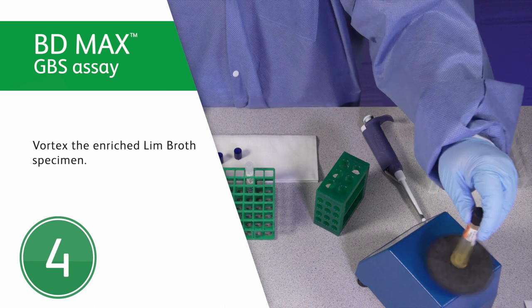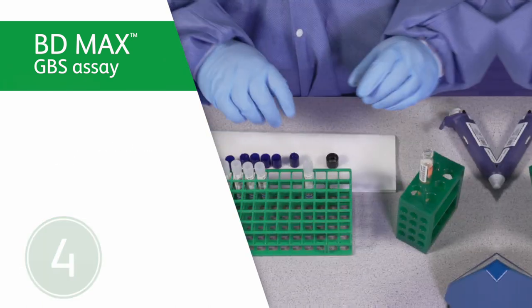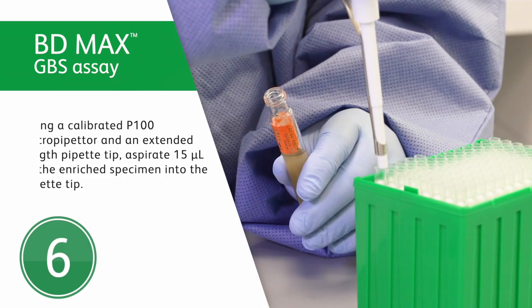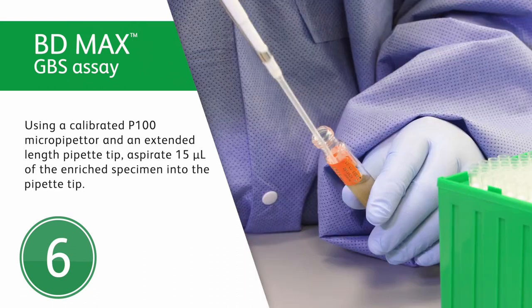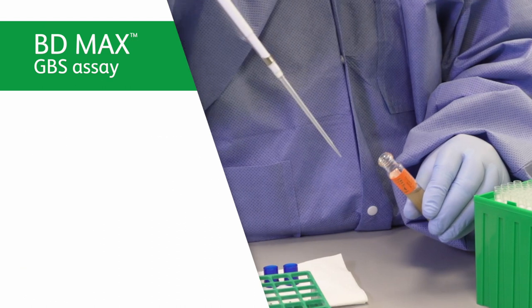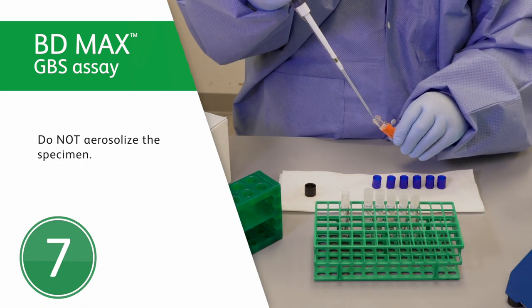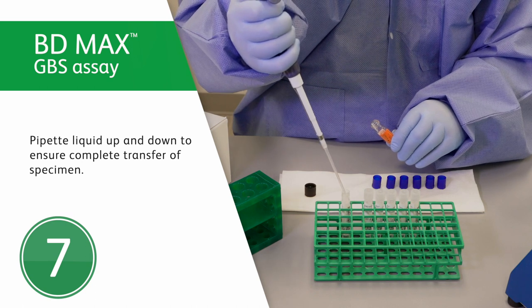Incubate the inoculated LIM broth for at least 18 hours at 37 degrees Celsius in ambient air or 5% CO2. After incubation, vortex the enriched LIM broth specimen to achieve uniform distribution. Remove the cap on a BD-MAX GBS sample preparation reagent tube. Using a calibrated P100 micropipetter and an extended-length pipette tip, aspirate 15 microliters of the enriched specimen. The reason for using an extended-length tip is to avoid contaminating the micropipetter with the enriched specimen. Dispense the 15 microliters of enriched specimen into the tube, taking care not to aerosolize the specimen. Pipette the liquid up and down to ensure complete transfer of the specimen.